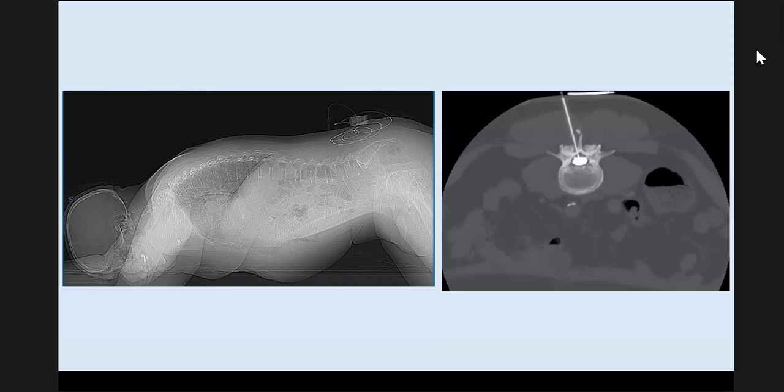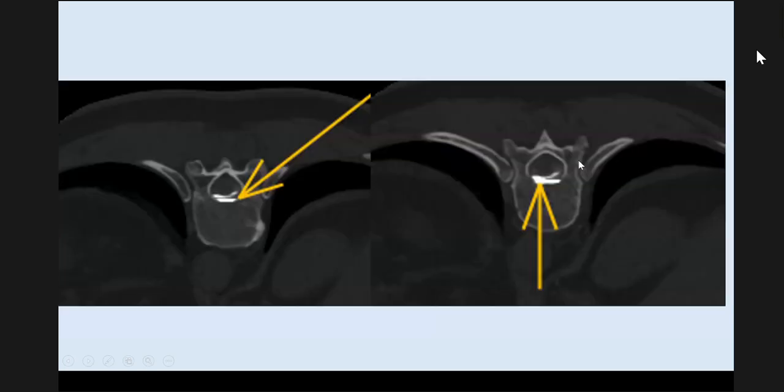and we would start by injecting the contrast in the prone position. And as you can see, lumbar puncture, injection of contrast into the thecal sac filled up with contrast there. And you can actually see collection of abnormally located contrast.